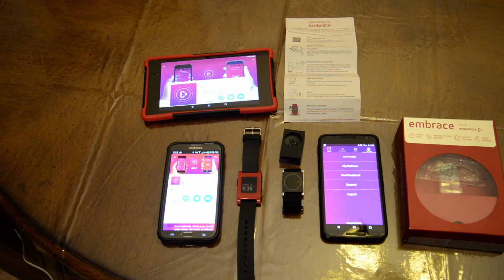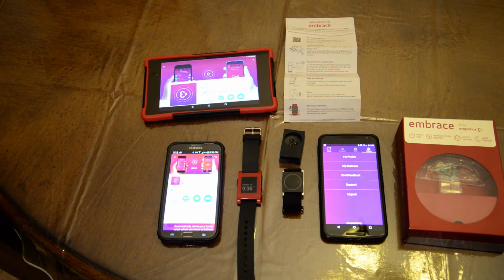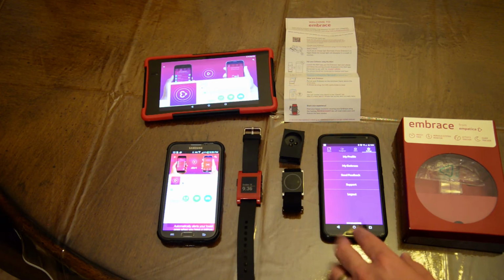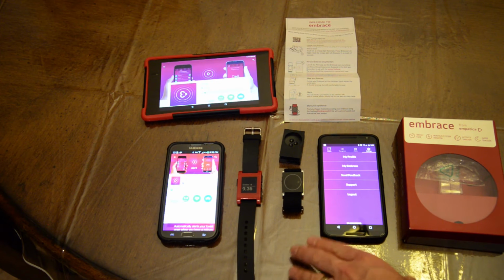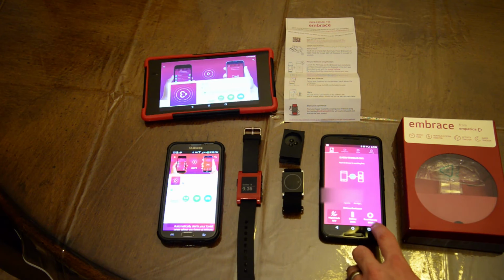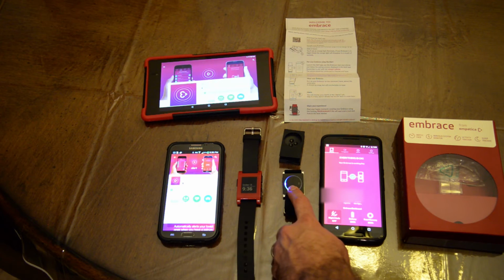Hopefully that changes in the future, because my end goal is to connect this watch to the tablet and leave it in my son's room, because this is my phone. I have to leave it in my son's room, because it is powered by Bluetooth. I haven't had any issues. You can take the phone with you and you can come back and it will automatically connect and update, and it will empty out the memory that has built up on your Embrace.